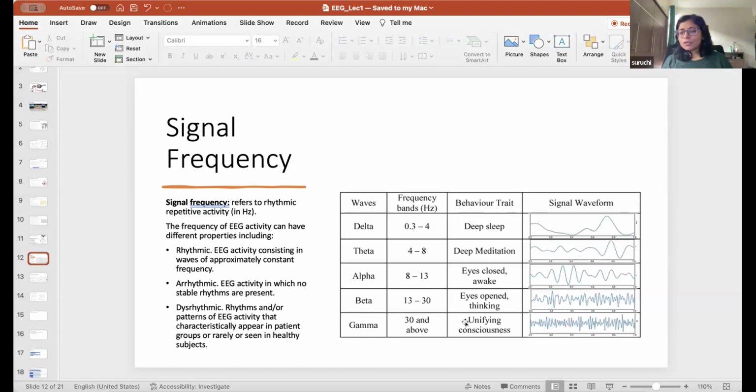It's a mixture, so we talk in terms of powers. It's not going to be a pure alpha or pure beta. It will be a composition of these. Then slowly you will see that alpha is decreasing and theta is increasing. If your theta increased and you didn't see any sleep spindles, then you will say that it is a deeply relaxed state. They are not sleeping. That's as good as it gets. You will sometimes get some power in delta also, though pure delta has never been shown to us so far. But some component of delta is there, so power in the delta band is increasing. We call them bands because they are not one frequency, they are a range of frequencies, like a band between this and this.